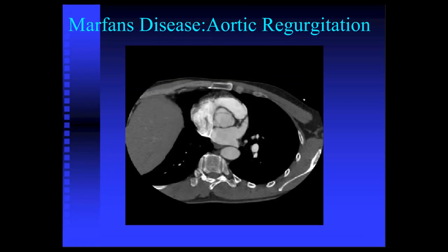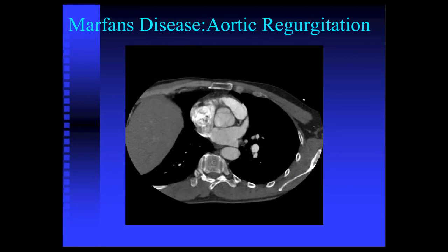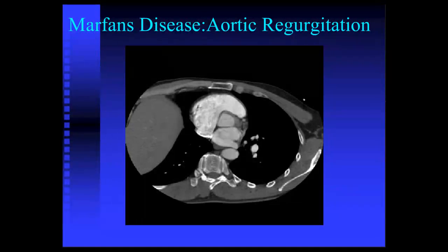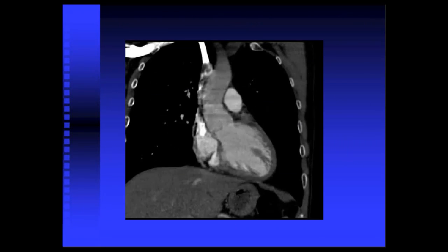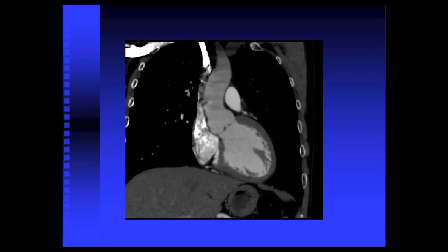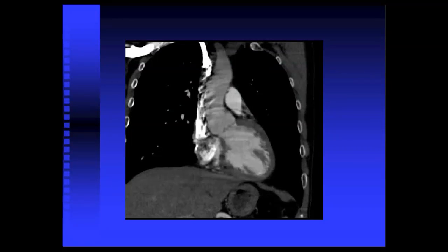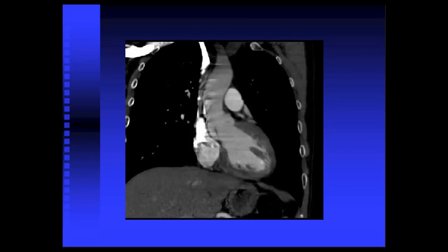While we can understand stenosis, we can also get insight into regurgitation. In this patient with Marfan's disease, the area of coaptation that should be closed shows a triangular opening — the valve does not completely coapt. This correlates with aortic regurgitation and insufficiency. Because of the spatial resolution and gating technology, we can see this fairly subtle finding: the leaflets are not completely coapted, which correlates with aortic insufficiency.